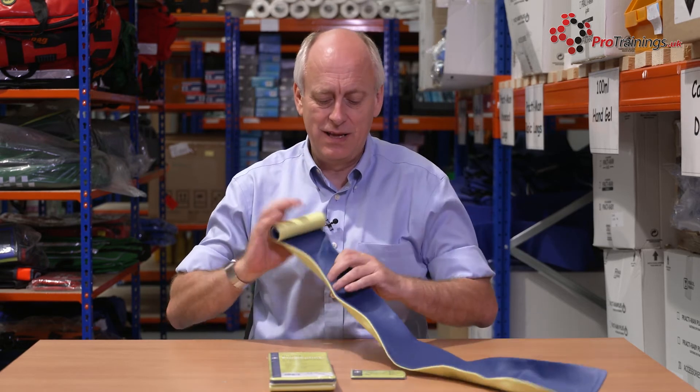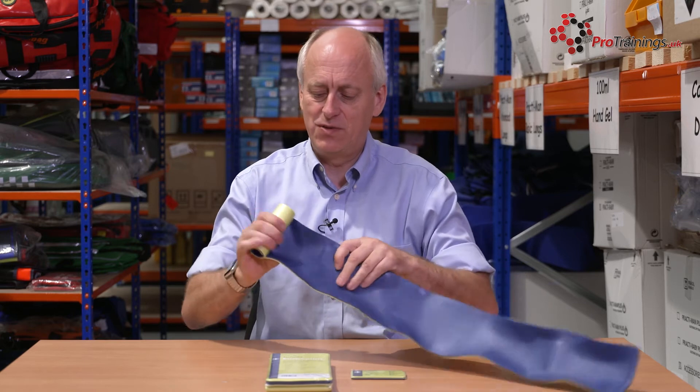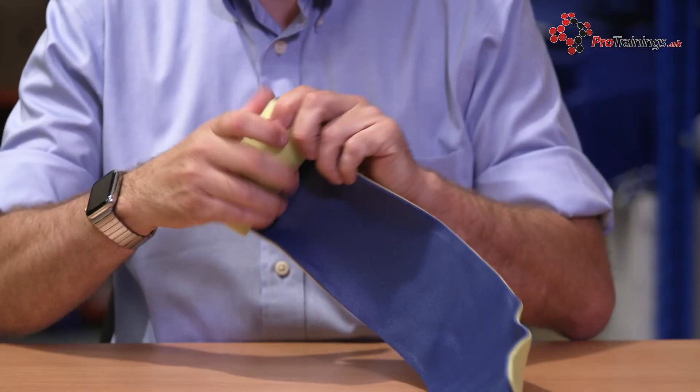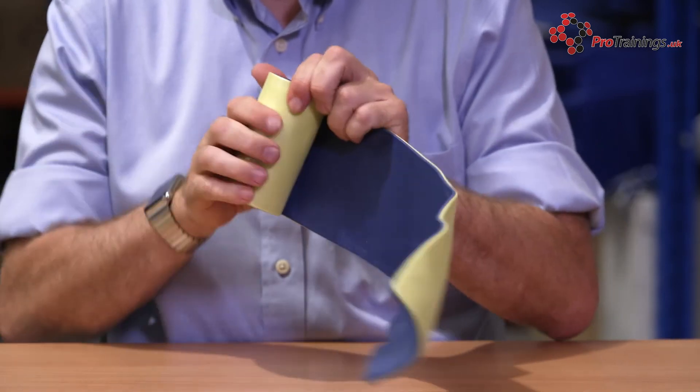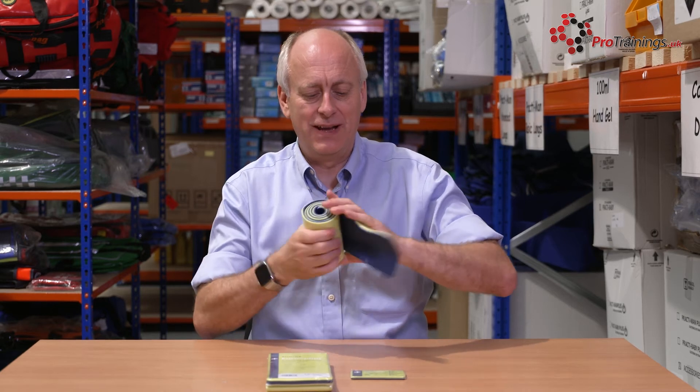If you're using this in the training world, you can reuse it - just open it up and flatten it back out again. Then if you just roll it back up again, hold it tight in your hand as you're rolling it up, it will take out all the curves that you've put into it, and eventually you'll get that rolled up nice.